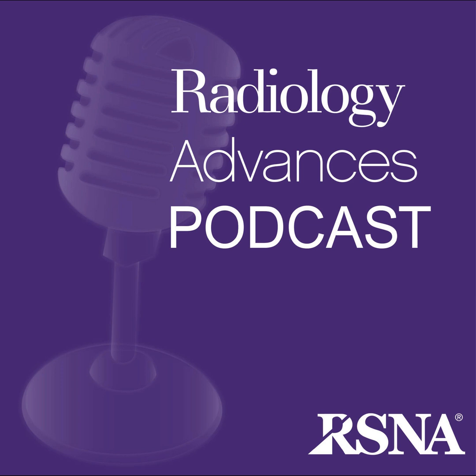You mentioned this was on a dual-layer scanner. What about other types of dual-energy CT scanners? They do touch on that. They suggest similar ED and ZF reconstructions might be possible on other platforms, dual-source rapid kV switching scanners, maybe even photon-counting CT in the future, but they rightly caution that this needs specific investigation. What do the authors themselves point out as weaknesses of this study?